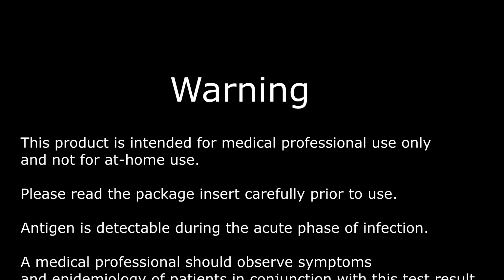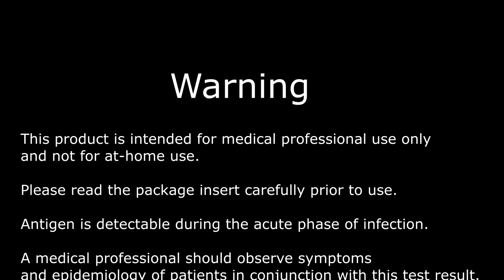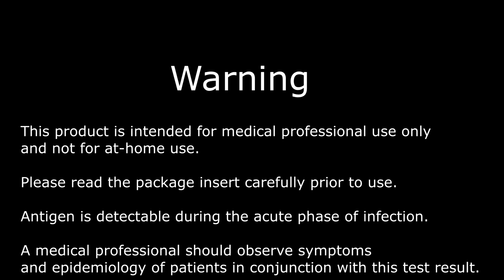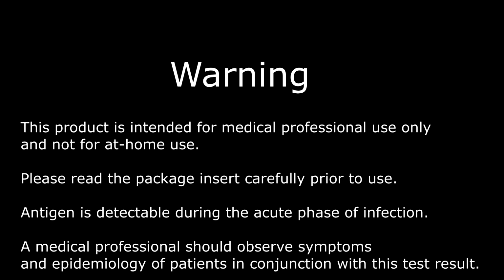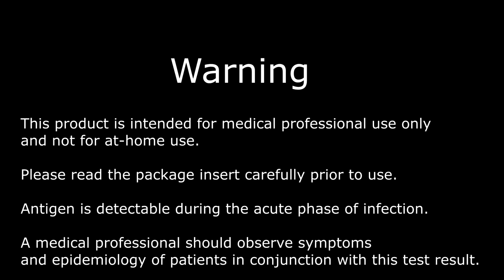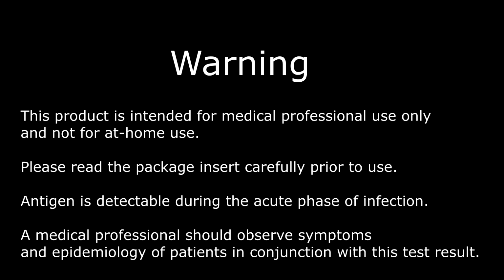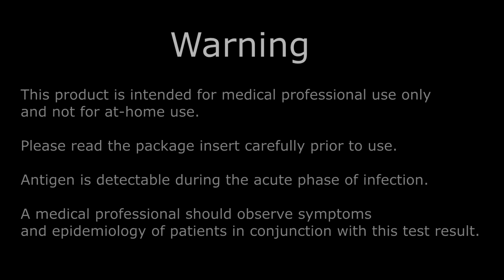Warning: this product is intended for medical professional use only and not for at-home use. Please read the package insert carefully prior to use. Antigen is detectable during the acute phase of infection. A medical professional should observe symptoms and epidemiology of patients in conjunction with this test result.